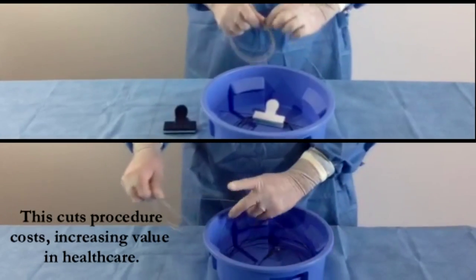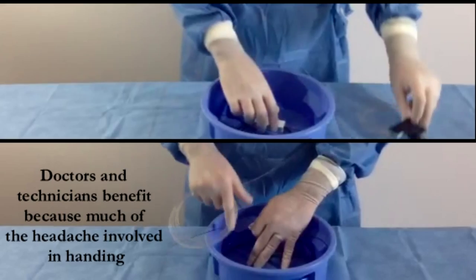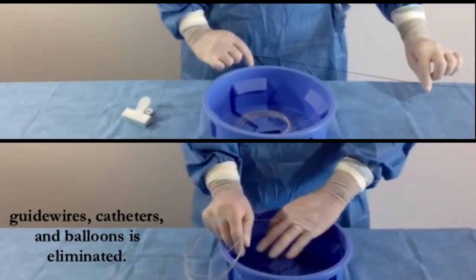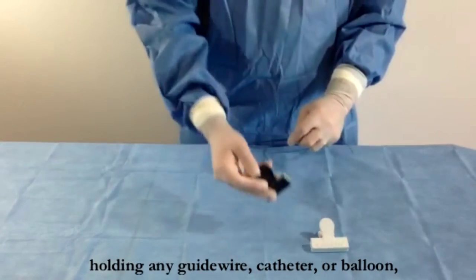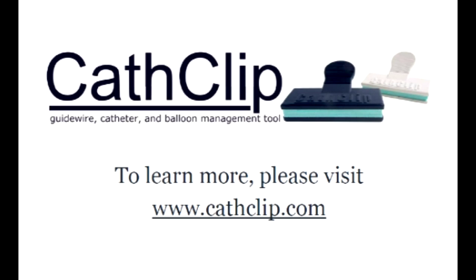This cuts procedure costs, increasing value in health care. It also benefits patients by decreasing procedure time. Doctors and technicians benefit because much of the headache involved in handling guide wires, catheters, and balloons is eliminated. CathClip saves time and materials costs by holding any guide wire, catheter, or balloon gently and securely. It's like having an extra set of hands in the cath lab. To learn more about CathClip, please visit us at cathclip.com.